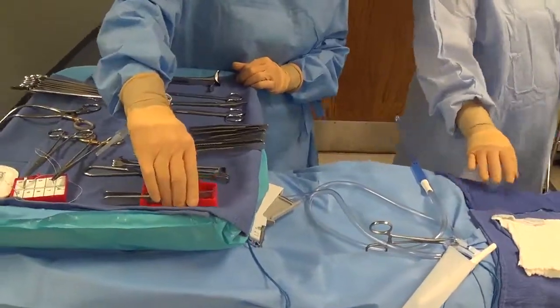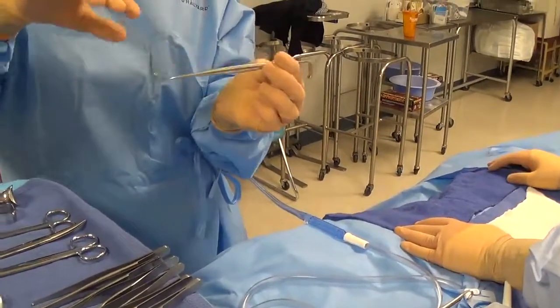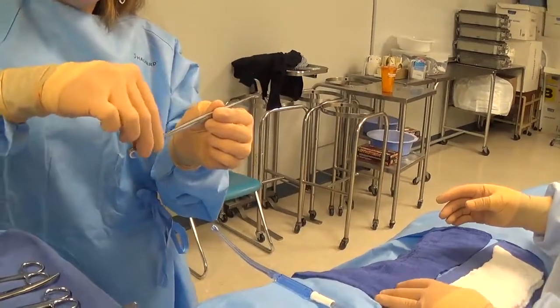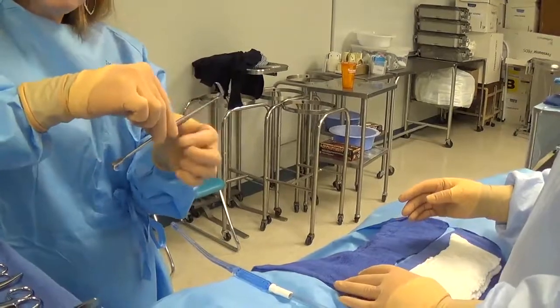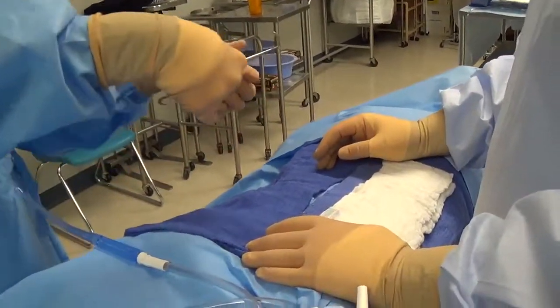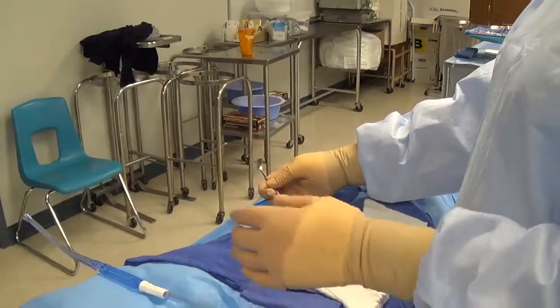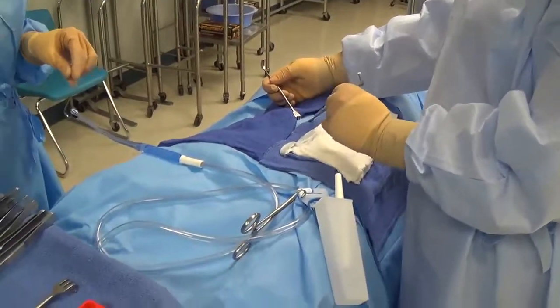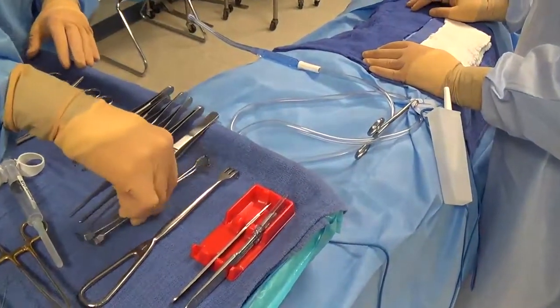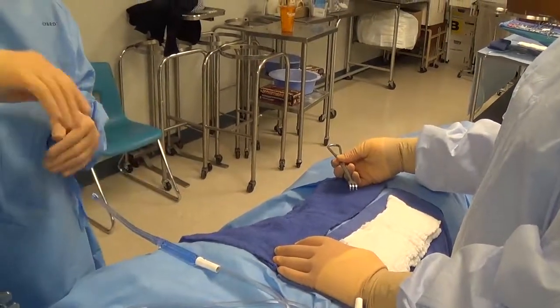For sharp retractors such as Senn rakes, three-prong rakes, or four-prong rakes, we want the rake portion to be down — not up — because you could get snagged if your hand doesn't clear in time. Hold it up on the shaft of the instrument, not on the sharp, leaving enough space for the surgeon to grab it, then hand it up to the field. Make sure you stay on top of the instrument and don't rotate your fingers underneath. If these sharp items get laid on the drapes, pick them up right away so nobody gets poked and there's no contamination.